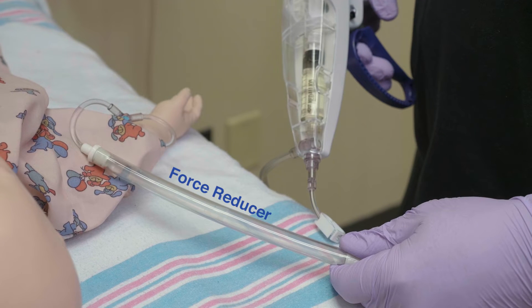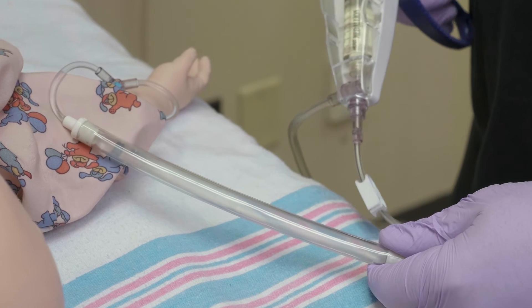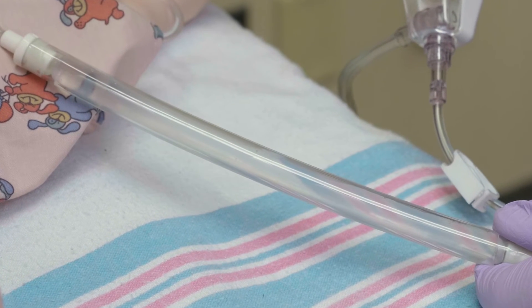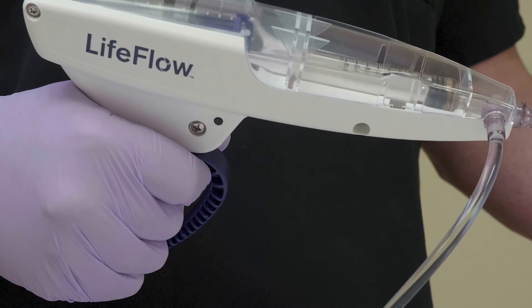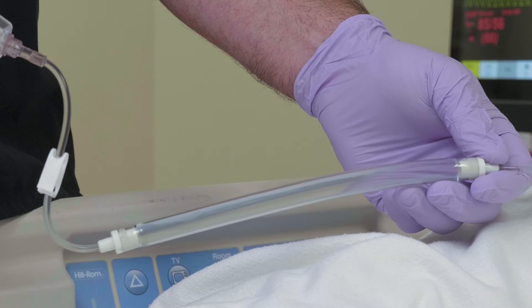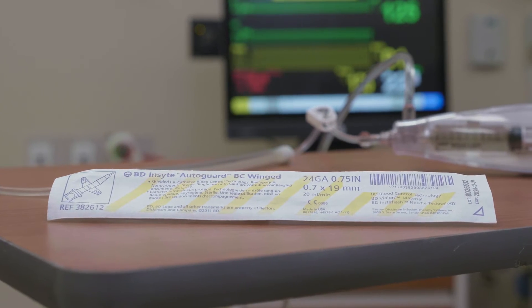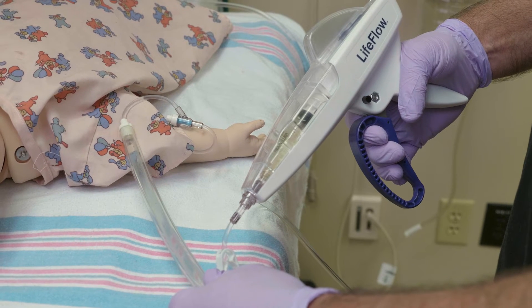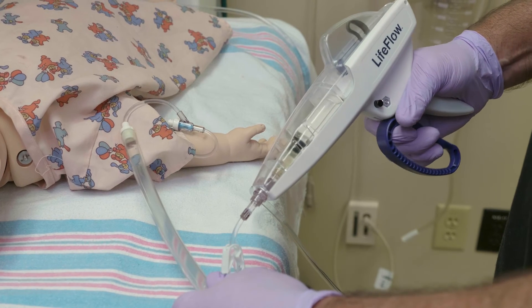The force reducer makes infusion easier and smoother through small catheters. As the force reducer becomes saturated, the LifeFlow trigger will be noticeably harder to squeeze. A short pause between squeezes will allow excess fluid within the force reducer to dissipate. With a 24-gauge IV, after each trigger cycle, a short pause will be necessary. It may be useful to say to yourself: go slow for better flow.